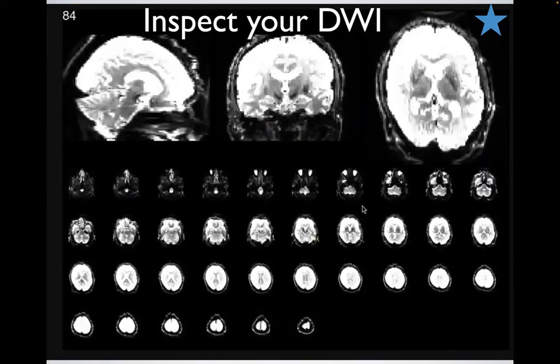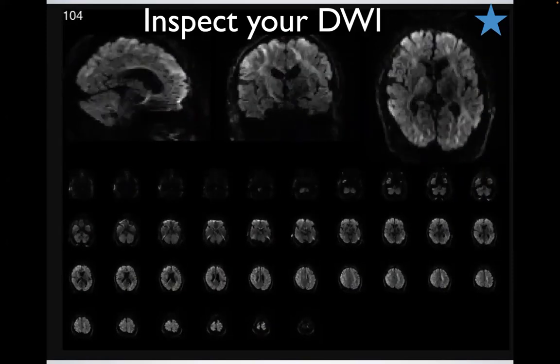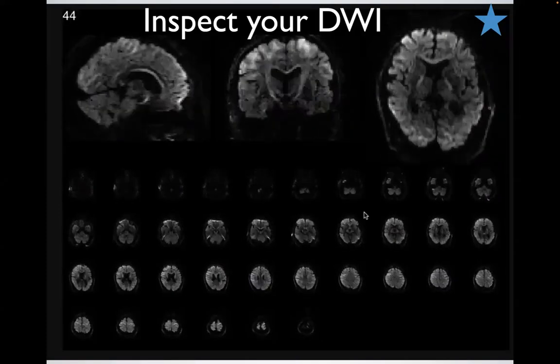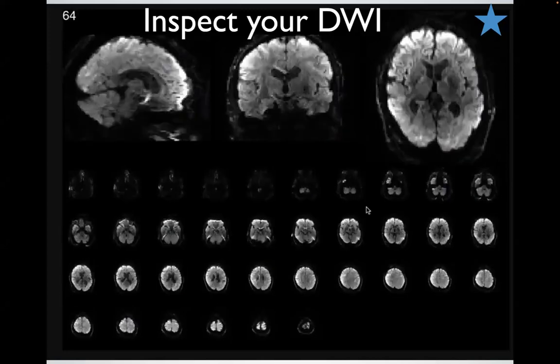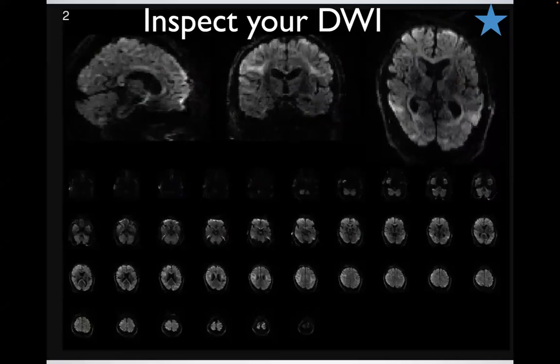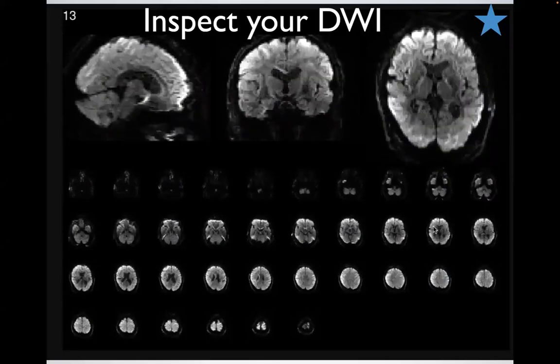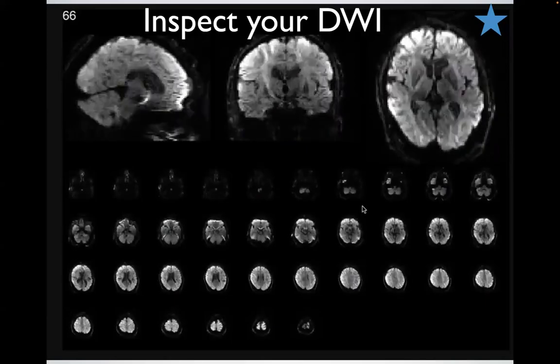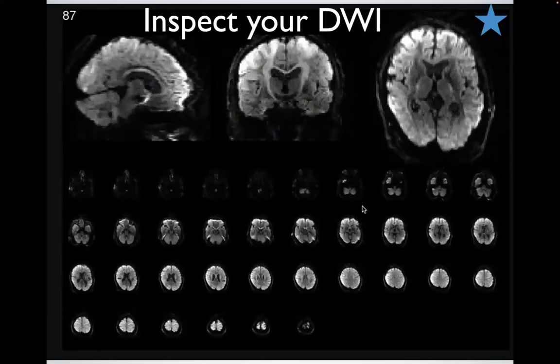And I could spend a full hour teaching diffusion and the physics of diffusion and why this is, I mean, the cool thing is that this is feasible in 10 minutes. Why is it feasible? We need acceleration. We need to go quickly. We're acquiring 3D images every 5 seconds in space.